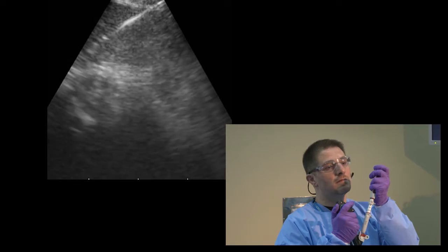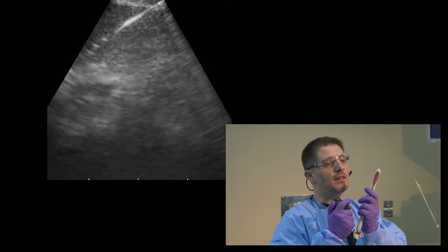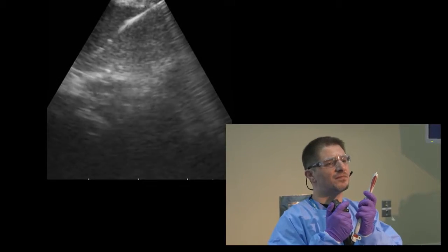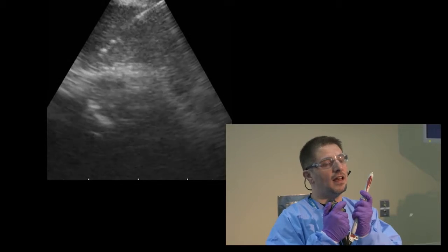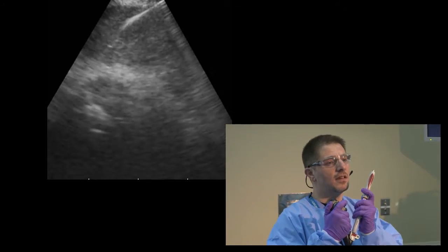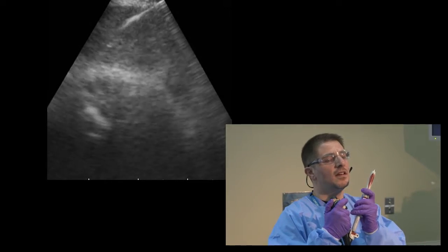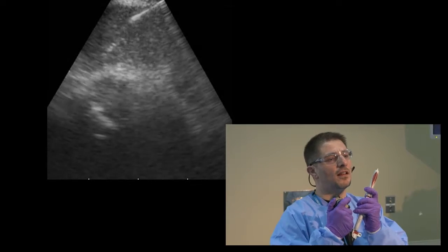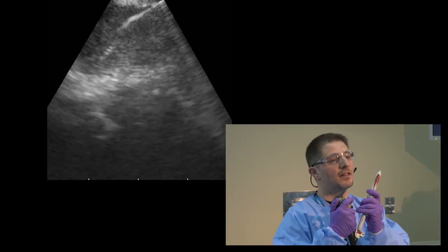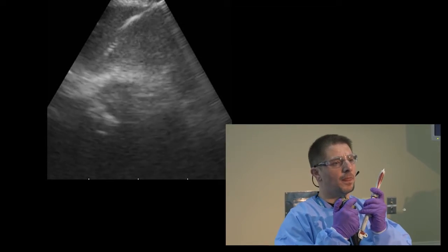Then you pull the stylet halfway and do the capillary action. It's good to apply this in lymph nodes that are vascular like this, and start sampling without suction. The reason is that you know there is a blood vessel and there is a chance of getting a lot of blood with suction, and that can make reading the slide for on-site cytological evaluation harder.